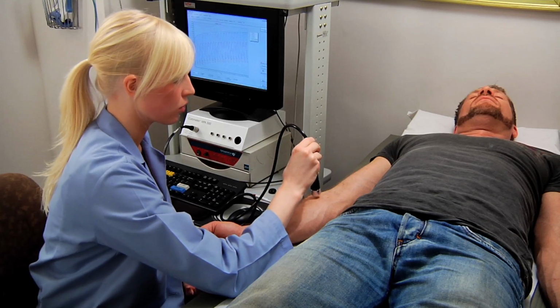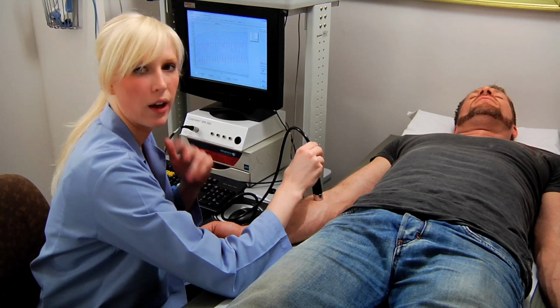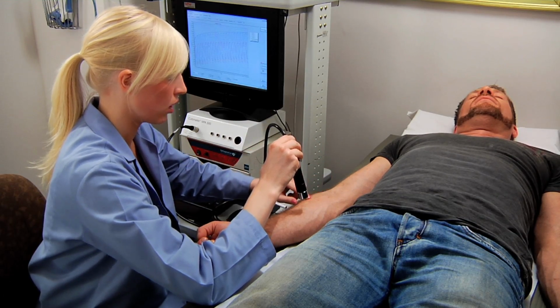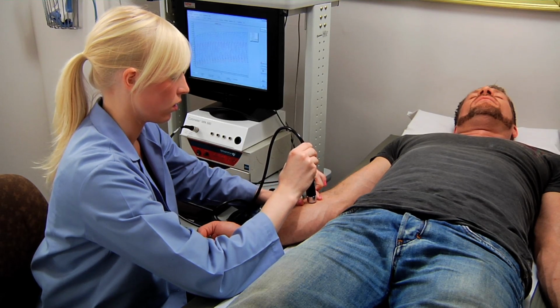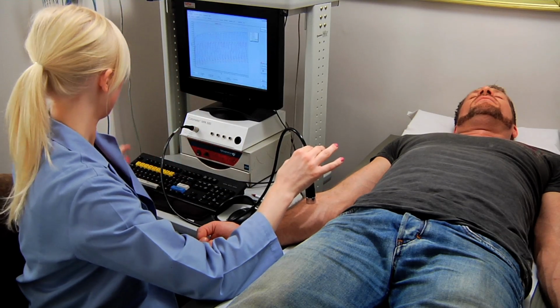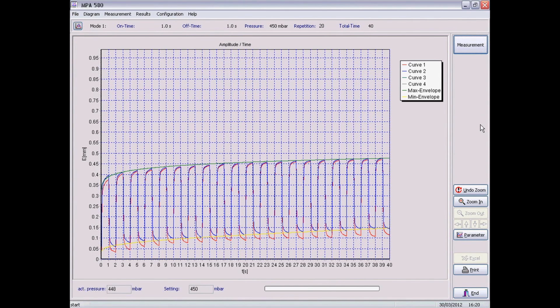And instead of being directly above the original position, you're going to go directly below it, 1/2 inch. So I use my pen mark as reference to where I went for the first curve. I place the probe down. Same thing, hit the space bar. It pressurizes, hit the space bar again, and curve 3 is now being generated.